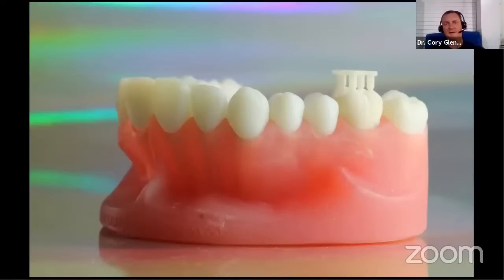And I found these to fit incredibly well. This is the one I designed for the molar. If you look at the marginal integrity there, it is excellent on this. There's no perceivable marginal gaps or anything. Again, provided you did your design and matched it up at the margin.